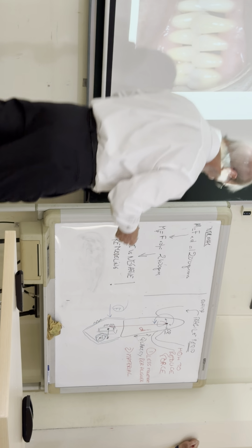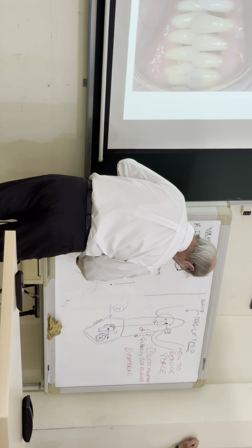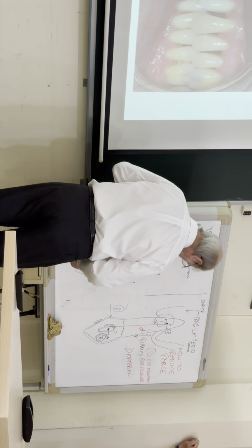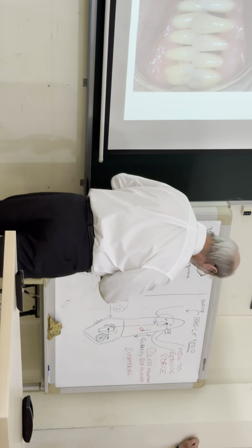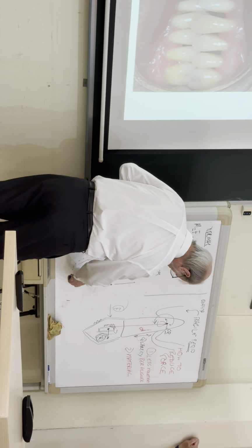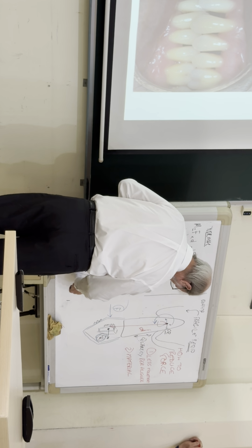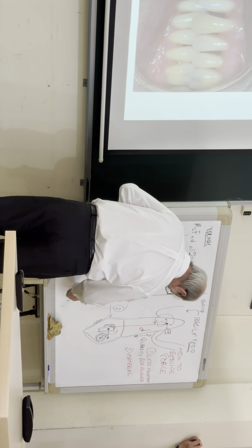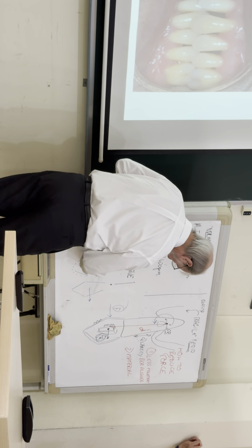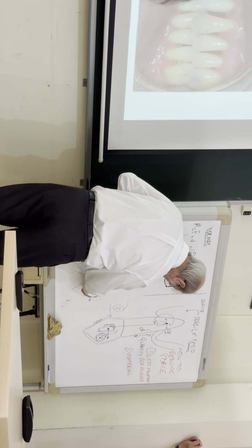Okay. This is the perio tooth. You push on it. It tends to come forward and rotate, right? If you reduce the activation, it should be okay. But if you're not too sure, what you can do also is put the force, which is going to give you this moment, and make another little one with an attachment.